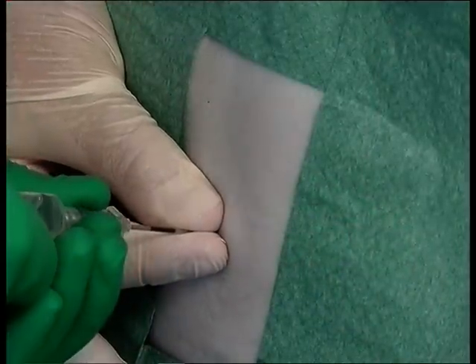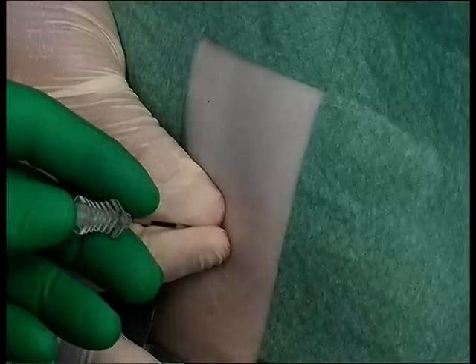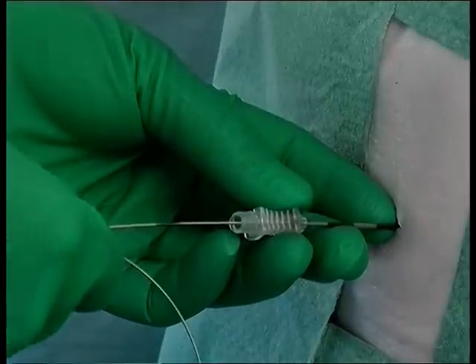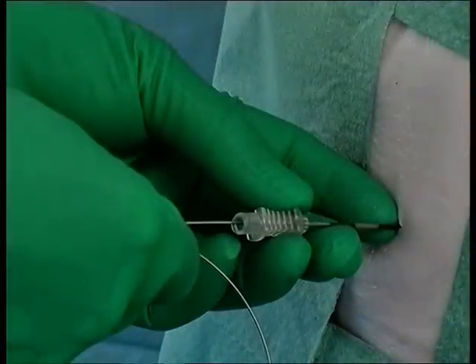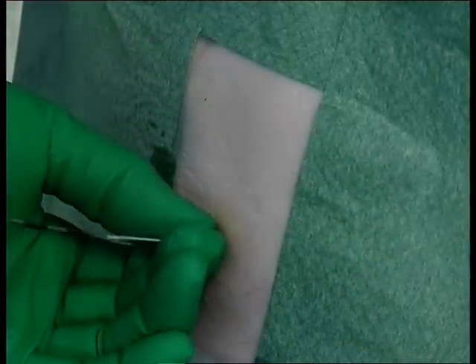Detach the syringe. Angle the needle to direct the guide wire towards the apex of the pleural cavity for a pneumothorax, or the base for fluid drainage. Straighten the tip of the guide wire with the introducer and insert into the hub of the needle. It must be easy to pass and should meet no resistance in the pleural cavity. Insert the wire to the marker and then carefully withdraw the needle, ensuring the guide wire remains in place.